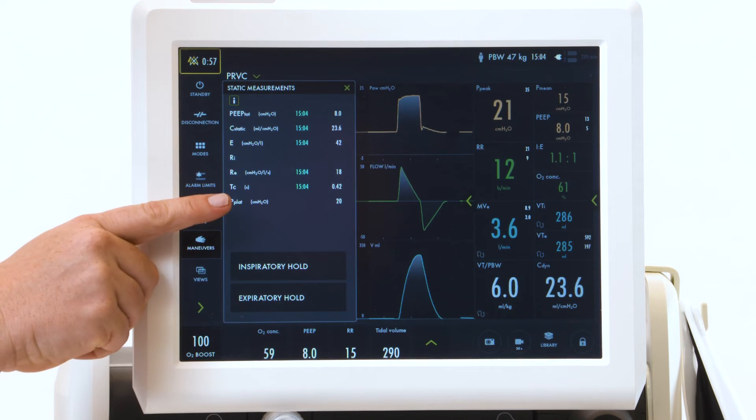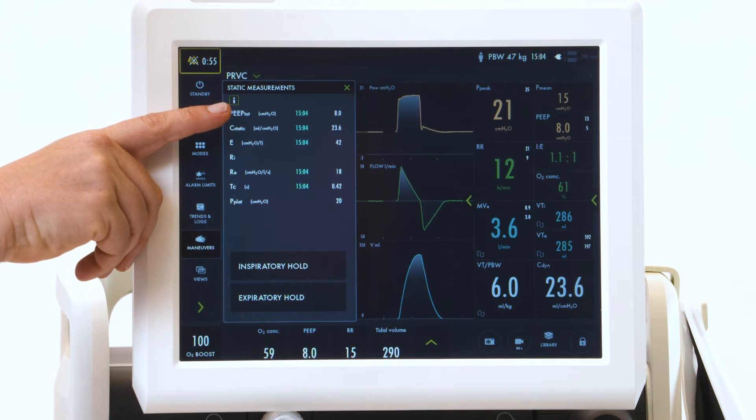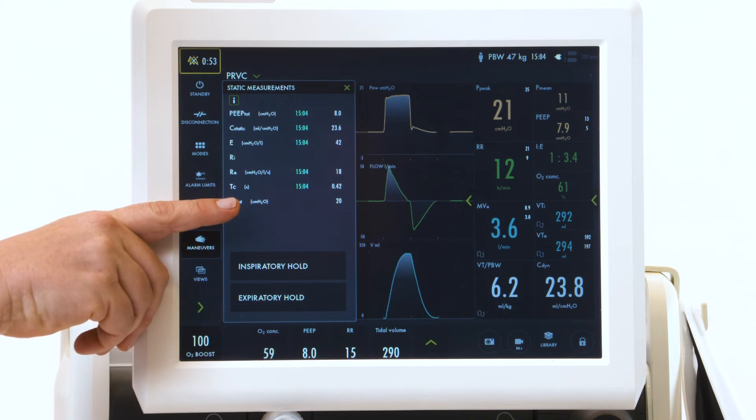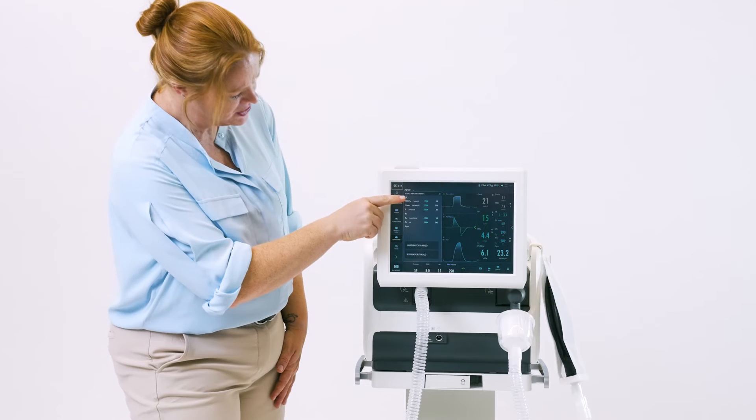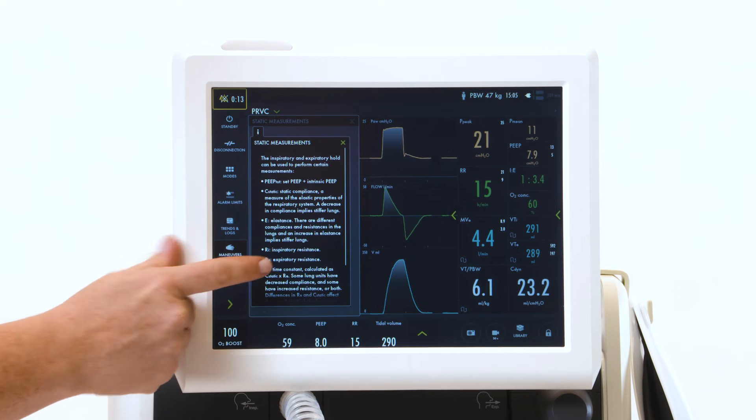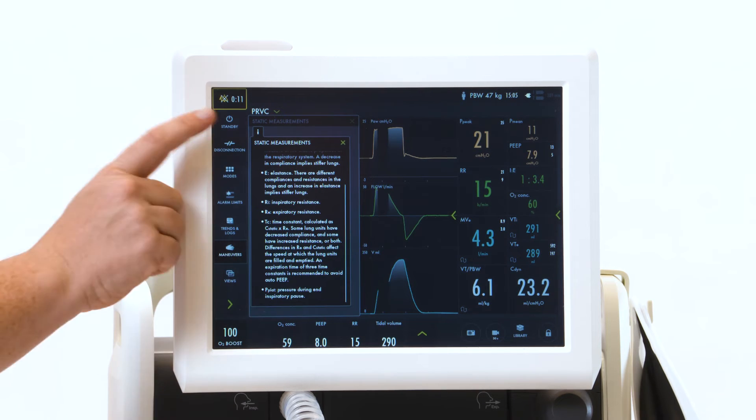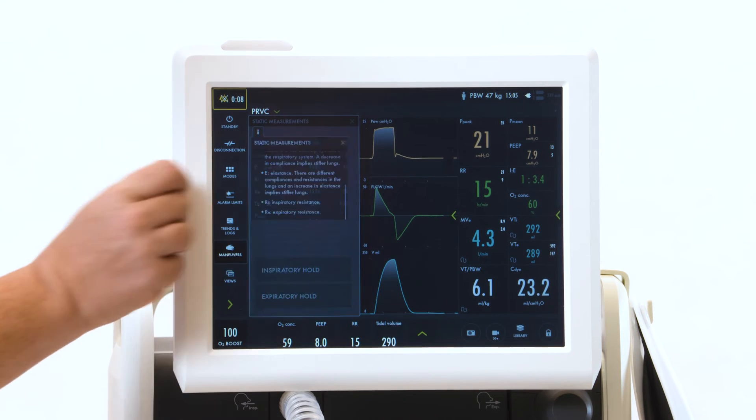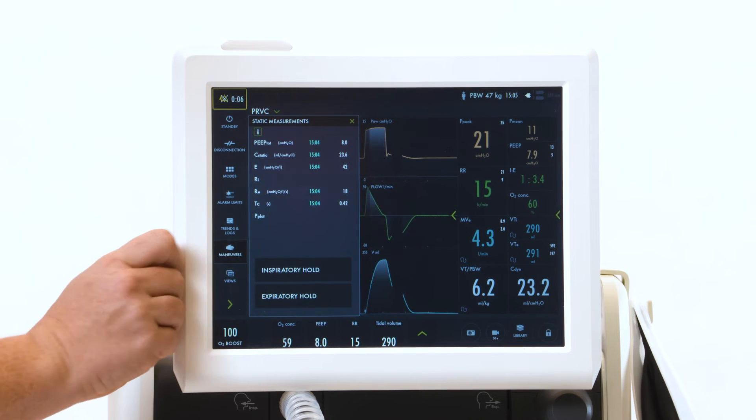Your numbers will appear, including your total PEEP, your plateau pressure, and your static compliance. Under your eye is the values. You can scroll to get the definitions of all the values which are measured underneath your measurements.